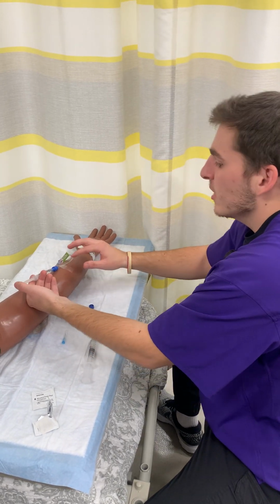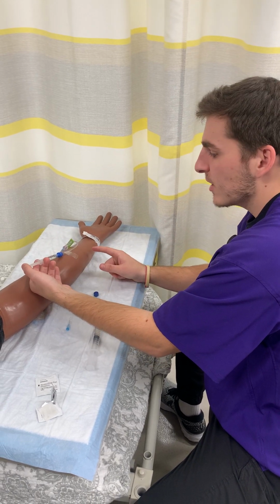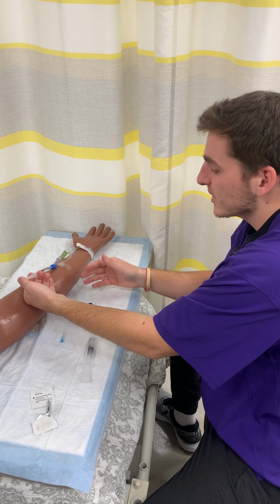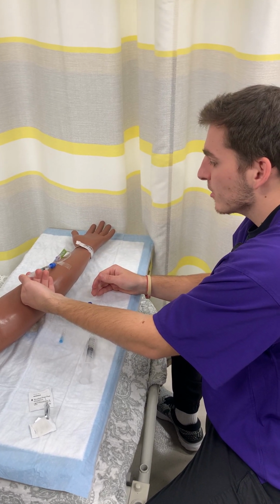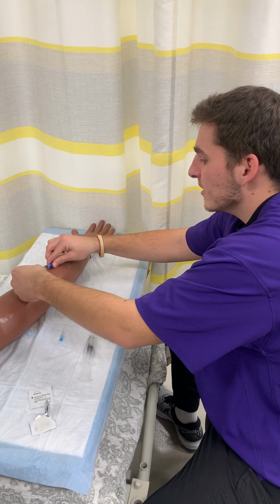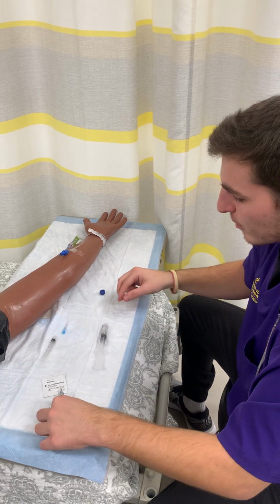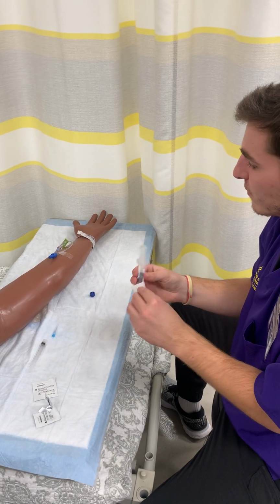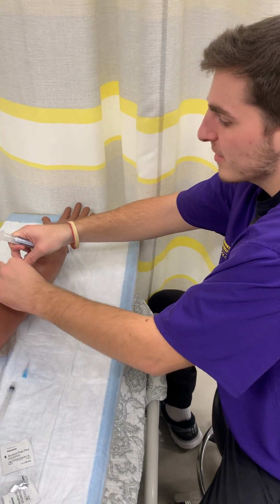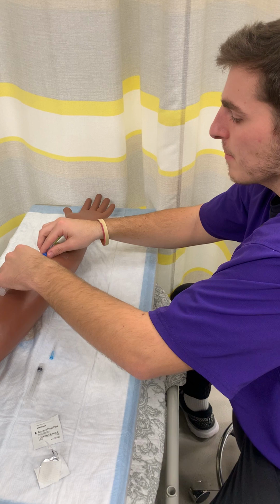Just make sure that nothing's getting outside of the vein, and I would push this, like I said, over 1 ml a minute. So I'm just going to give it slow, but I'm just verbalizing this. So I would give this as well. Then I would take this off, and I'm going to re-scrub this and just flush it again at the same rate that I gave the dexamethasone. So about 1 ml a minute again.